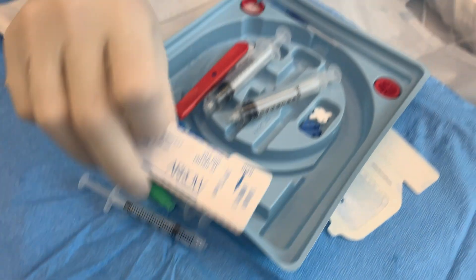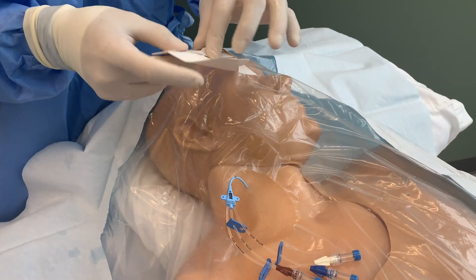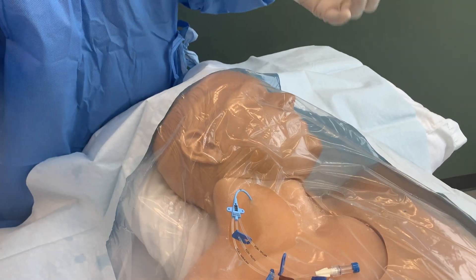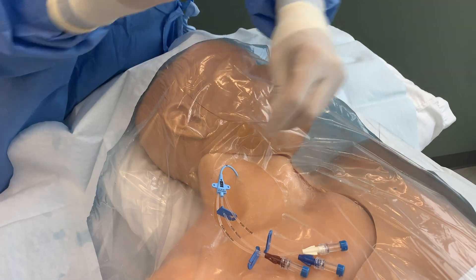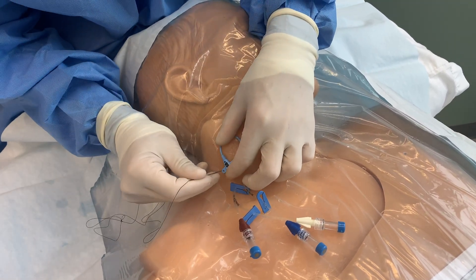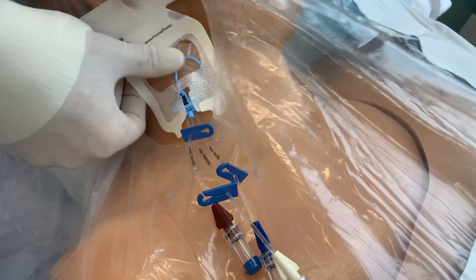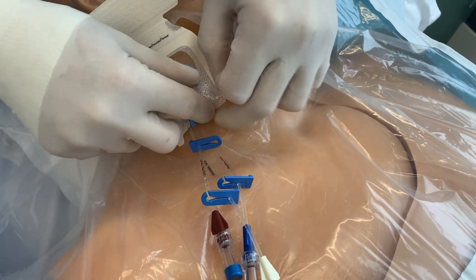Secure the central line using your preferred suturing technique. For dressing, depending on your institutional policy, place a tegaderm with or without a biopatch, and then remove the drapes while securing the catheter.